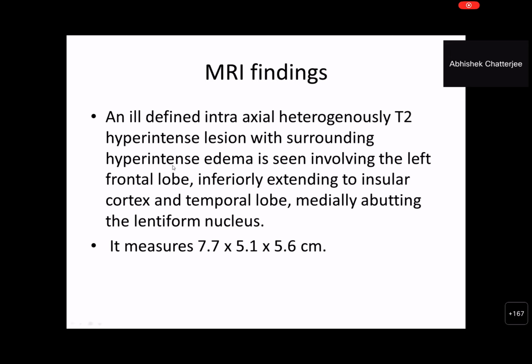So let's not go into the IDH now. Basically what Abhishek is trying to tell you is a diffuse lesion in an adult. What is that hyperintense edema? Can you see anything, Abhishek, that edema will suggest? If we have multiple sequences, especially, you will have infiltrative disease and reactive vasogenic edema. So across multiple sequences, you can make some attempt at distinguishing them. It also helps distinguish some further characteristics, which we will come to later. So all of this adds information.